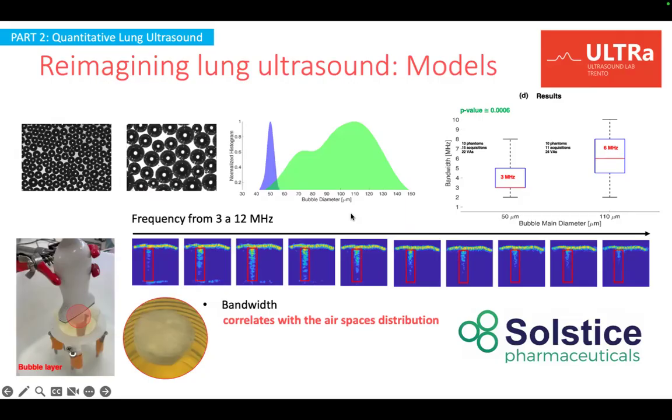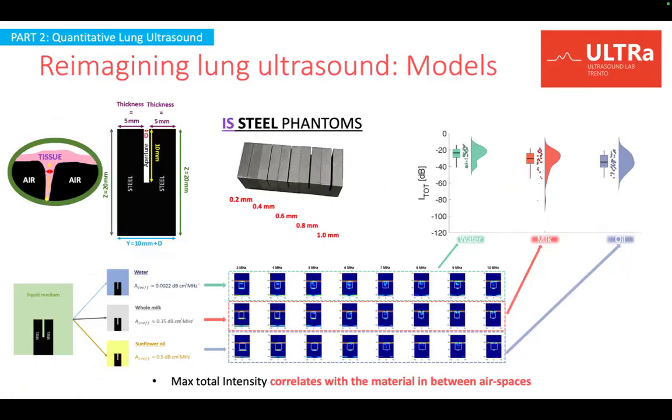Well, that's very interesting. And then we did recently another study where we generated phantoms mimicking septa in this case. And this enabled us to study whether total intensity would change as a function of the material filling the septa.